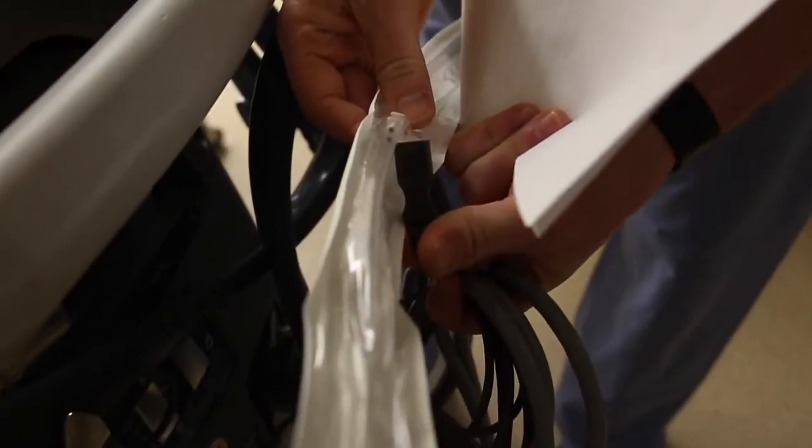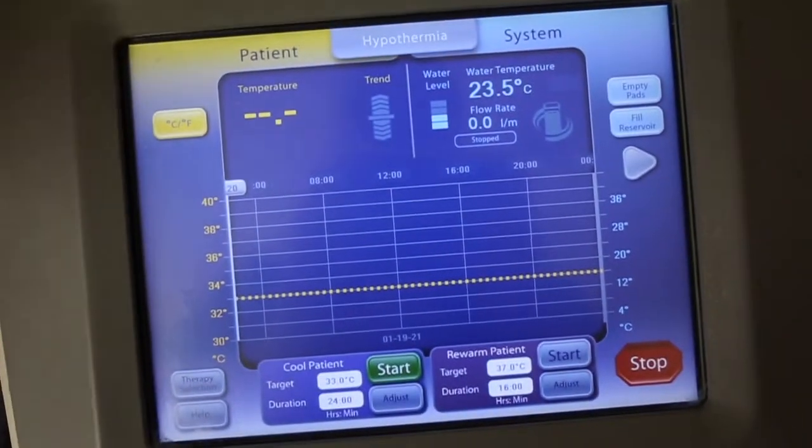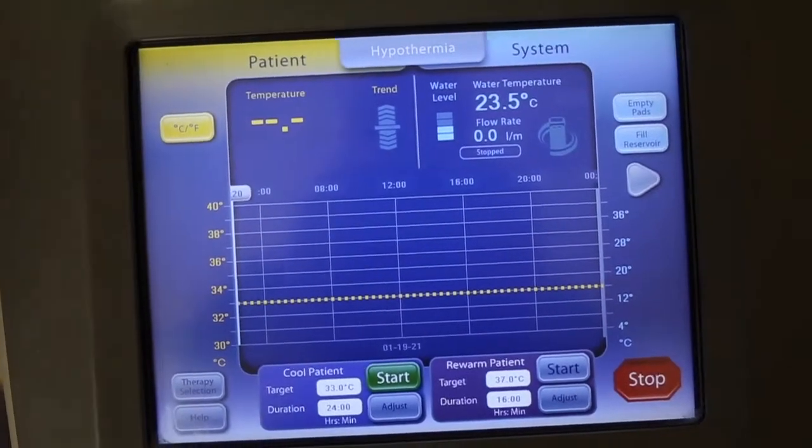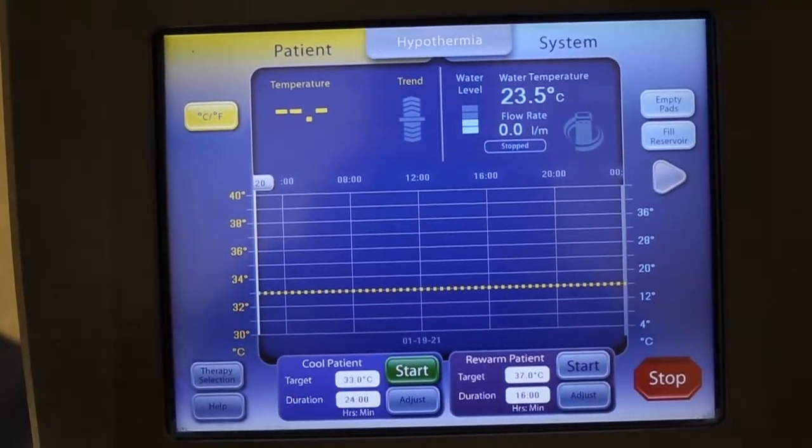The Arctic Sun needs this to monitor the patient's body temperature as it cools them. This is esophageal or rectal. Once connected, you can start the treatment and it'll begin cooling the patient.